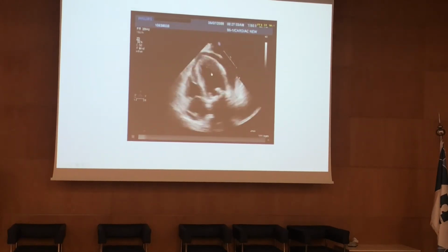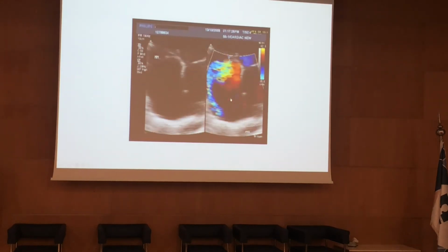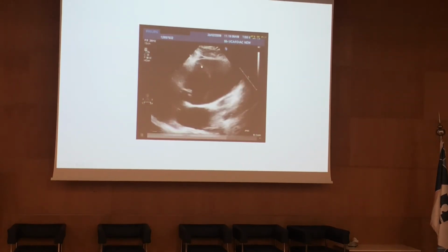So this is the left ventricle, right ventricle here, left atrium and right atrium. But the abnormal thing is this one. This is aortic dissection because of the dilated aorta. This is the flap. This is the normal wall, and this is the flap.